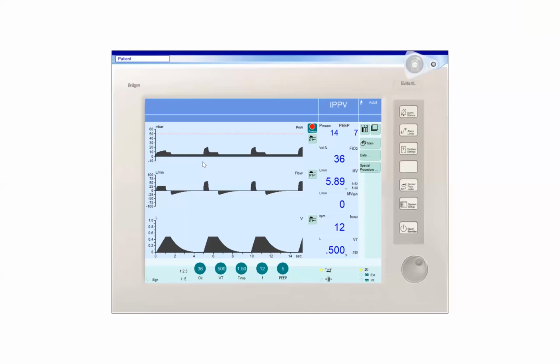Yeah. Because we increase the flow, now the air is delivered in a shorter time. So the pressure went high rapidly. Excellent. So the airway pressure is increased. Keep yourself unmuted so we can interact. So the initial rise is the airway pressure, and this is certainly related to the flow. The flow is doubled, so the pressure is increased. So the airway pressure is increased remarkably.